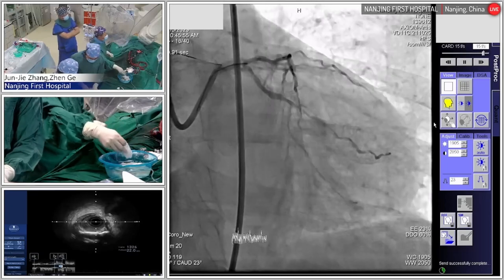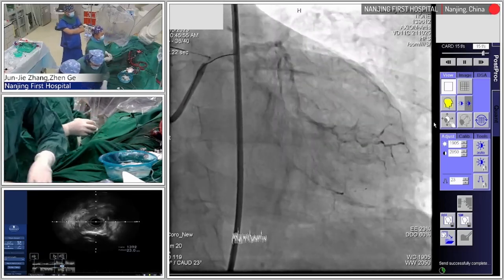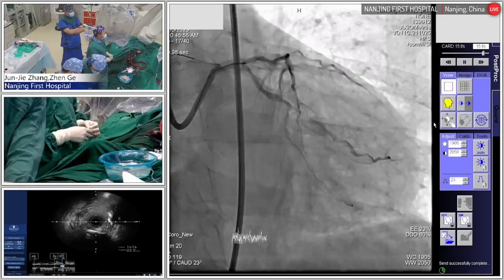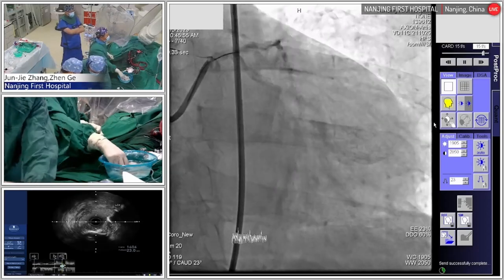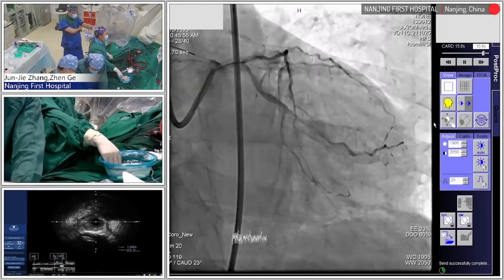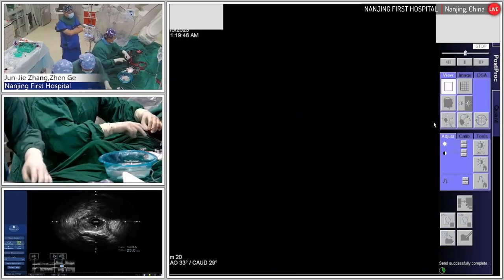Okay, thank you for this important question. This patient has no high BMI and a low ejection fraction, and unstable angina because of the old MI. Pressure a little damping. Be careful with your guiding catheter. Okay. Yeah, disengage a little.